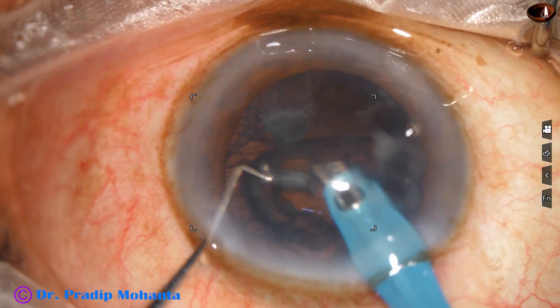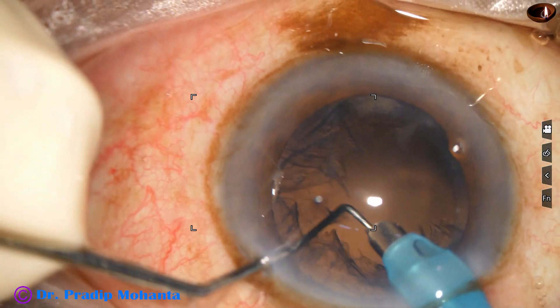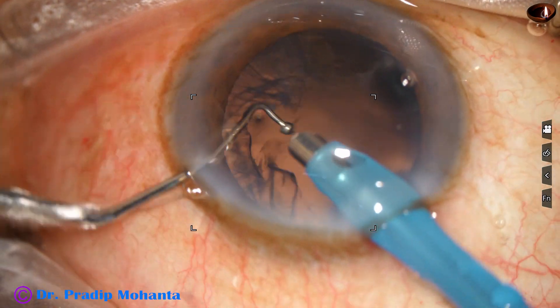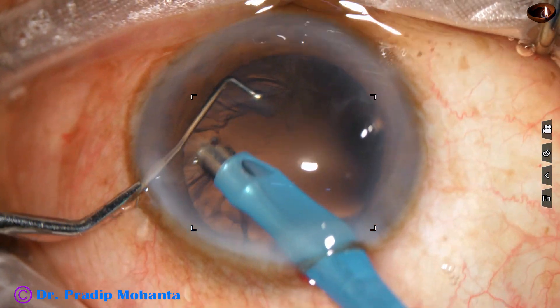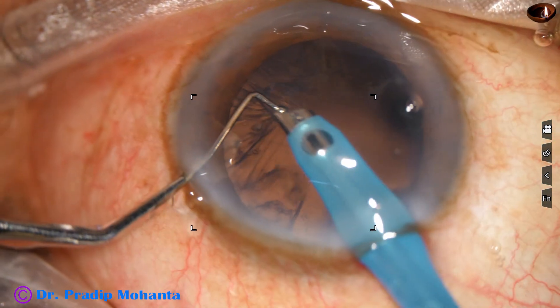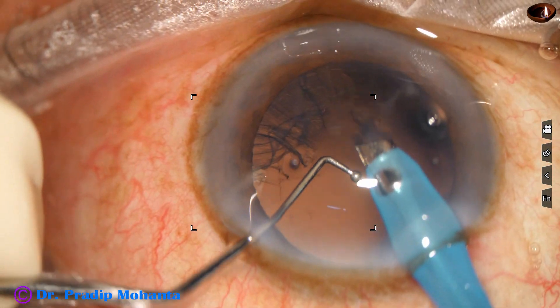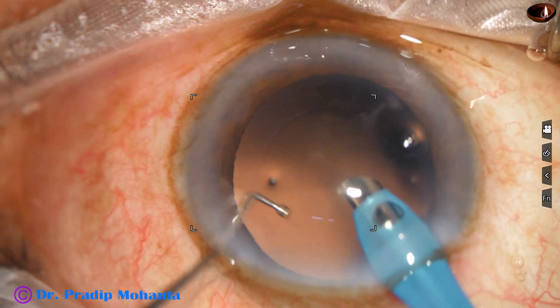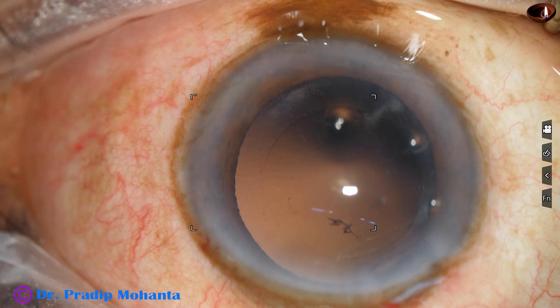Now the epinucleus is being removed. After that, by the handpiece itself, I am trying to remove the cortex. The long ball-tipped chopper goes down and protects the posterior capsule, and the cortex is removed by the handpiece itself.